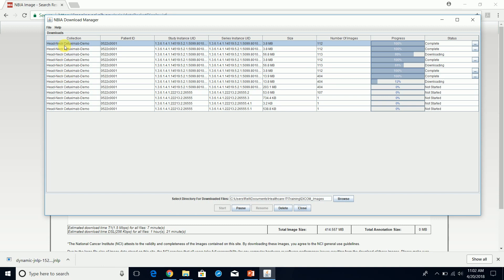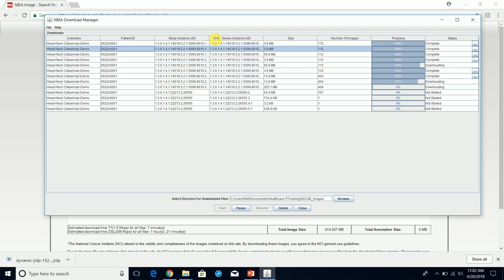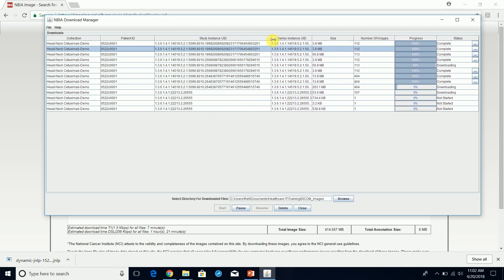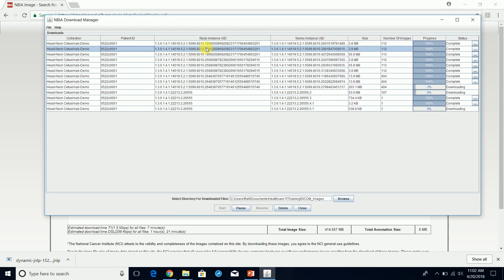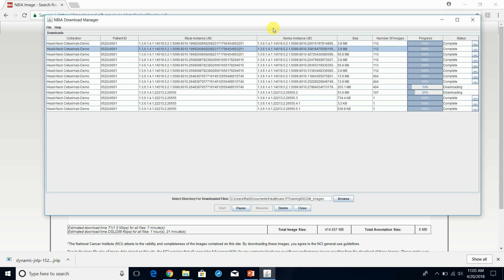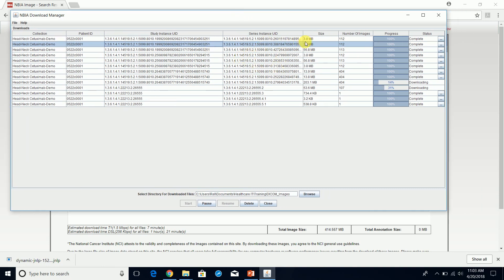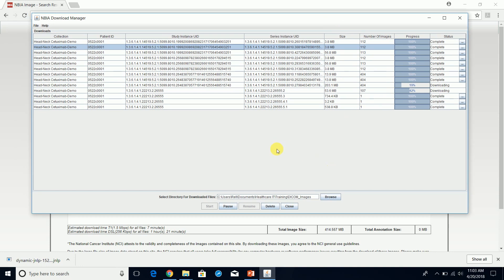Here is the study description. These are all anonymized studies, so they are unidentifiable. You have the patient ID and the study instance UID. It looks like we have downloaded more than one study — it looks like we have downloaded four studies. Once this completes, I'll pause the video and wait for the rest of the images to finish downloading.